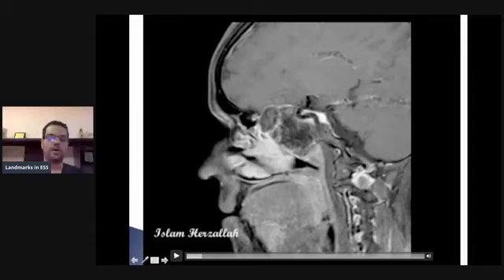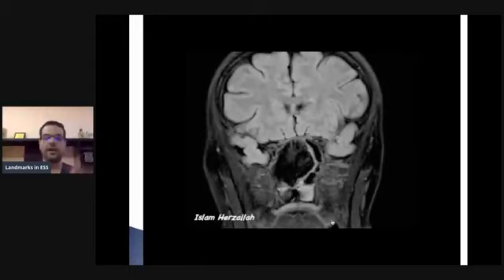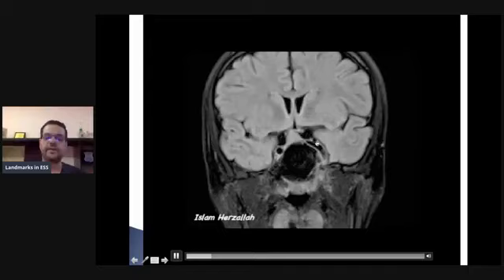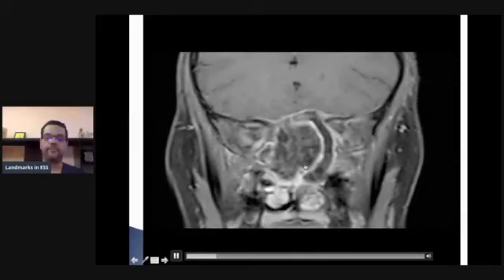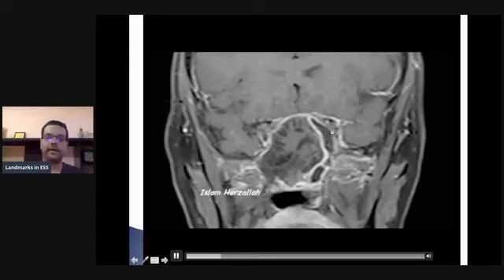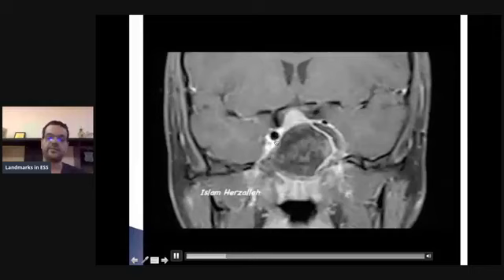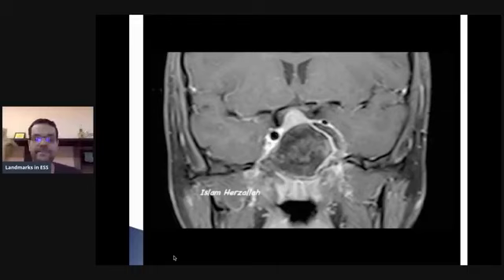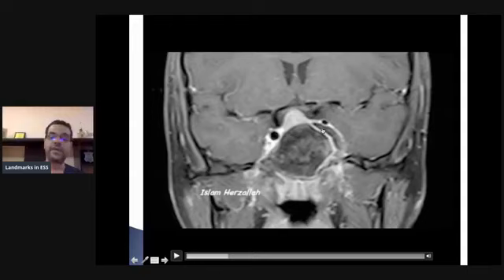Obviously, all the investigations were done for the patient, whether ophthalmology, MRI, a full assessment. That's the area where you see allergic mucin, and then you see the internal carotid artery turn, the C turn over here. This is the allergic mucin, and I'm going to show you the ICA right there. That is the ICA on the other side, and this is the ICA. Remember why I'm showing you this: this patient has perception of light, or probably hand movement, and needs a full clearance of her allergic mucin in this region. You can't just go there and leave this behind, because this is the aim of the operation, to clear all this allergic mucin from this region so that the patient has hope of regaining her vision.